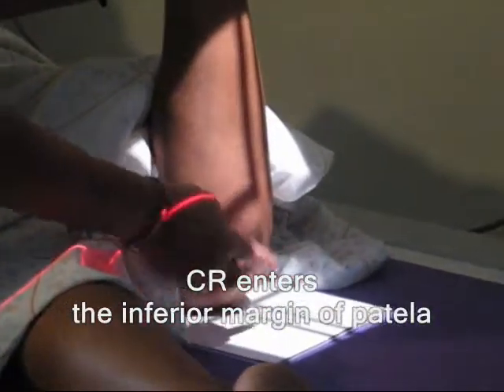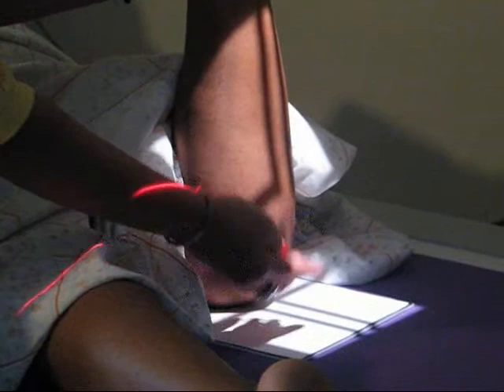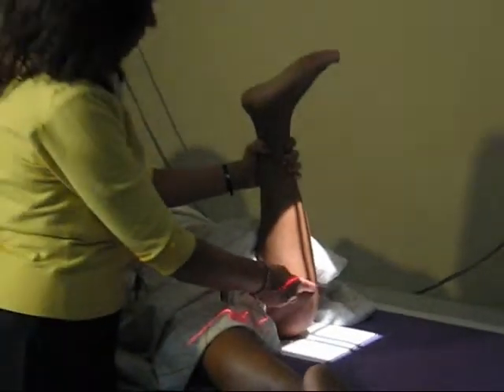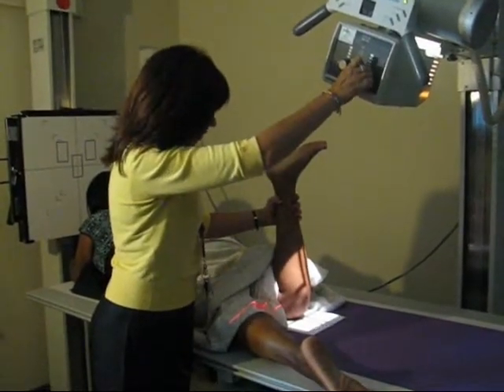Of course, the inferior margin is going to look like it's superior if we were looking at it this way, but this is the distal part of the inferior member, so that would be distal. Okay? And of course, we're going to collimate.